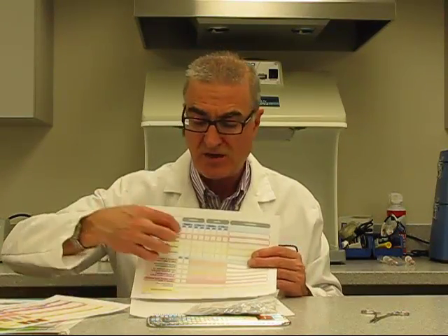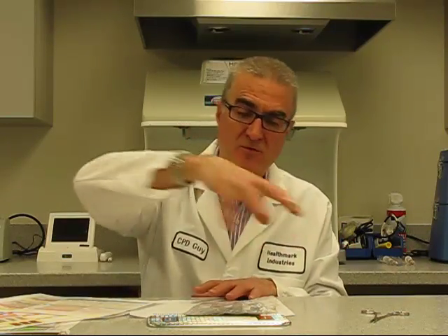Also, to reinforce cleaning the strainers. Those are very, very important in the washers. So again, it's a checklist for you to go through and make sure you're doing it, so that you're making sure that washer is working as optimally as we can. Because we do know if you have blocked spray arms, that prevents the water from coming through, and then it prevents it from getting on the instruments.